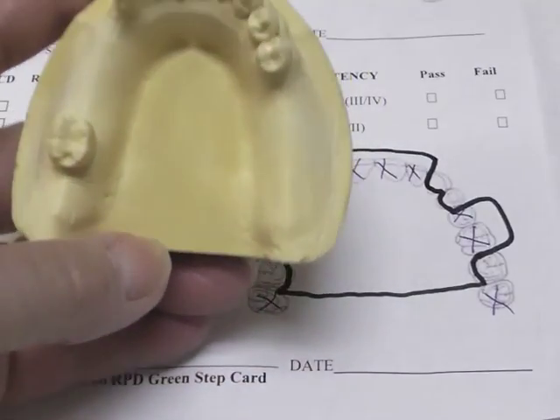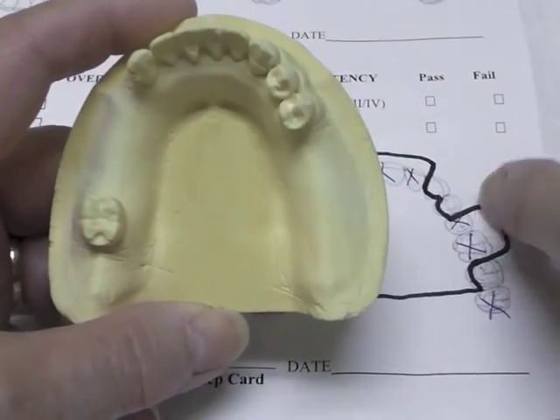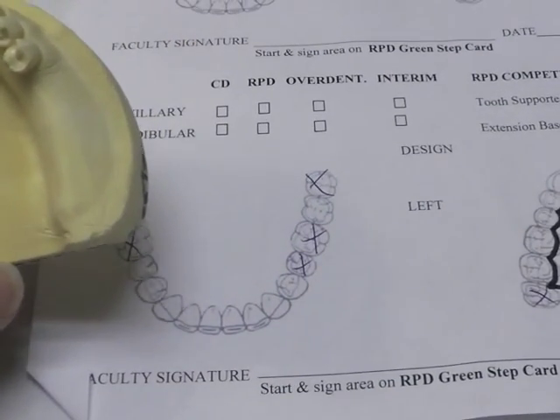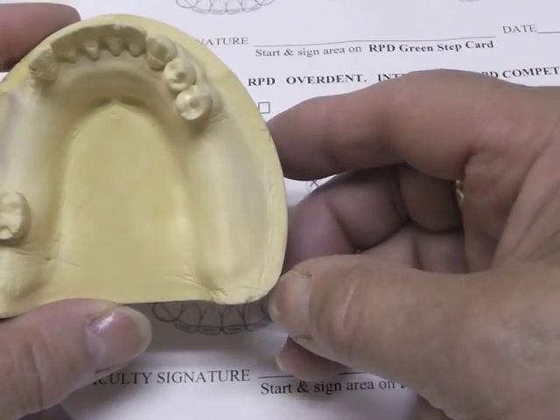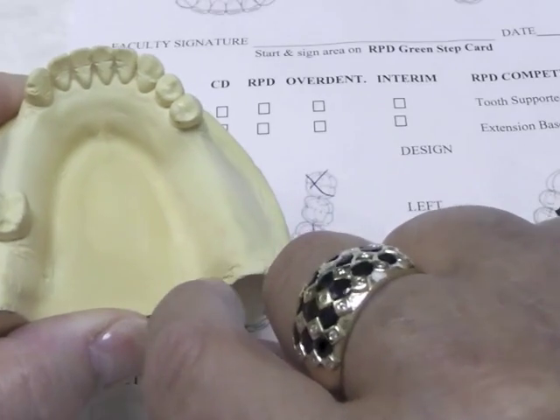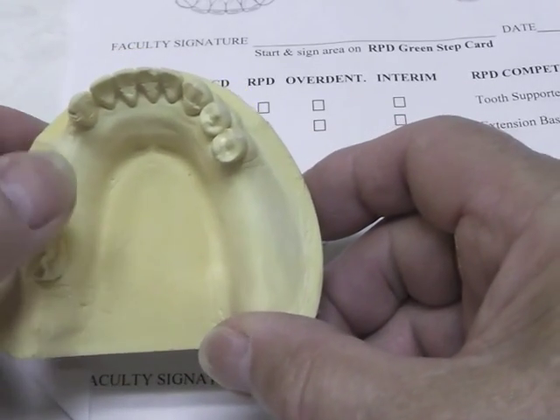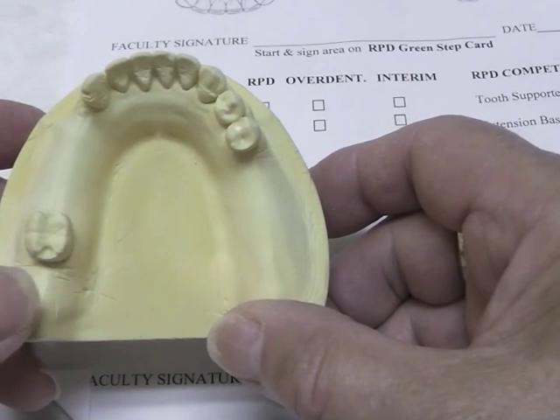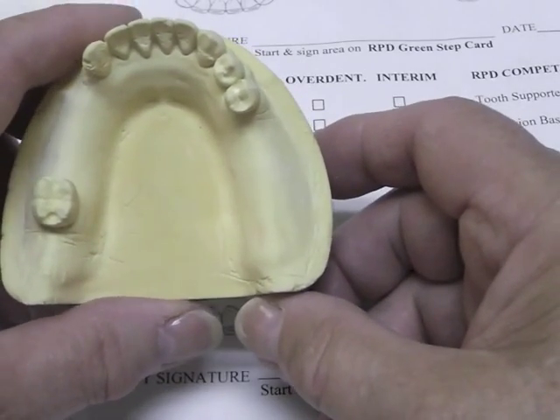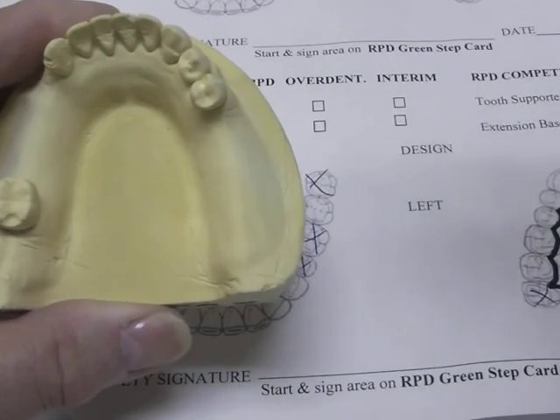For the mandibular base plate, we have an extension base area on this side. When you have an extension base area and make a record base, you should cover the retromolar pad at least half to two-thirds of the way up and extend into the retromylohyoid fossa, which will sometimes give you a little bit of retention. On this side I need a flange through this edentulous area, but I don't have to carry my base plate all the way back to cover the retromylohyoid fossa on the other side for stability. You want it to be broad and stable.